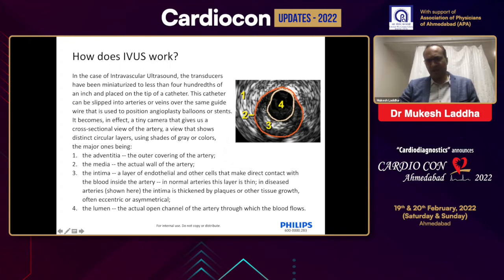So friends, as we know the total plaque burden, the lumen area, and the exact length of the lumen diameter, all these three are really helpful to select the size of the stent and to deploy it, and that gives you a better long-term result.